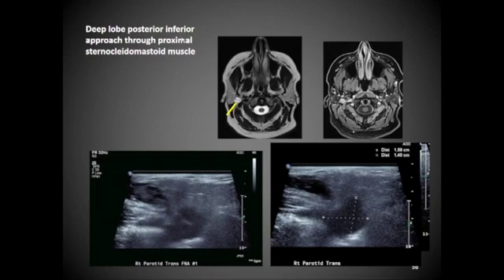If it is a very posterior or inferior lesion, you can do a posterior-inferior approach. You have to turn the patient, going way posterior-inferior, through the very origin of the sternocleidomastoid, and you can often get into something in this location without traversing any parotid and not crossing the plane of the nerve. I will say, though, the vertebral artery is not far away from this, so if I'm doing this approach, I find it and make sure I'm not going to stick it.